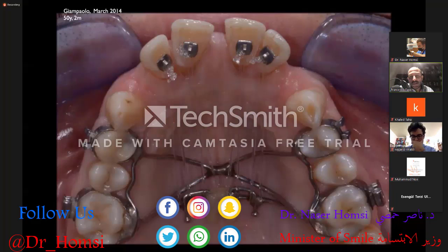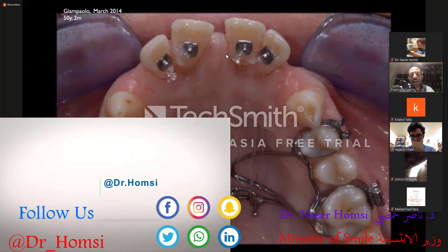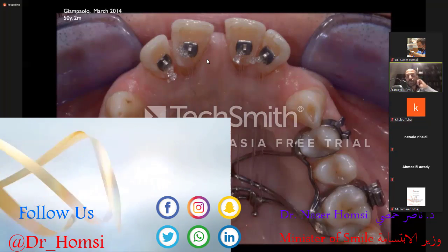We have some pins in the most posterior transpalatal bar, useful to obtain anchorage for elastics for intrusion and retraction. Elastics are positioned on eyelets bonded on the palatal side of the upper incisors.